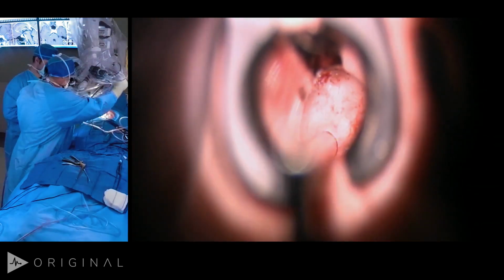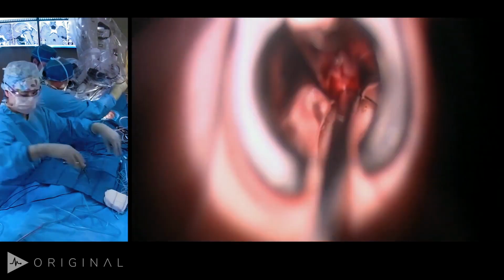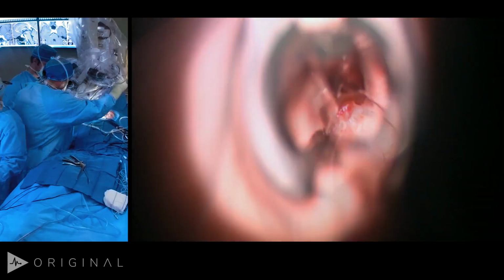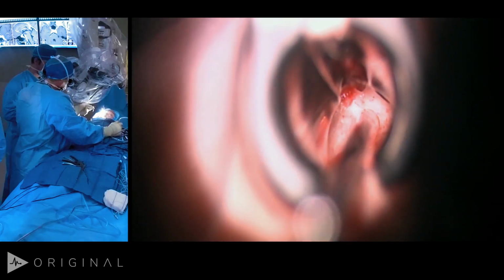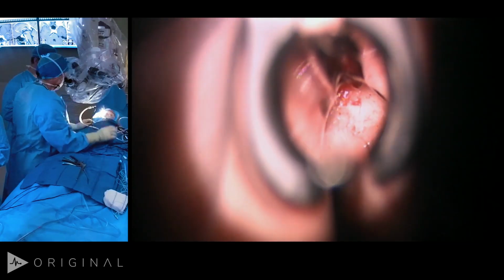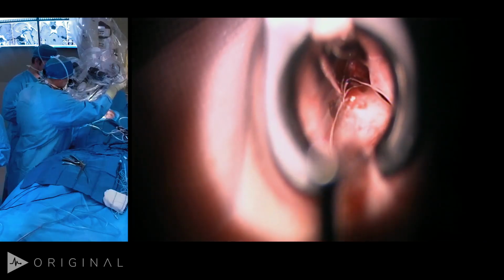In a thick sella, there's some abnormal bone in the sphenoid or the junction of the clivus with the sella that we'll leave alone. And I can feel the planum, frontal planum right up there. As we all know, there'll be a left carotid over there, a right carotid way over there. So we're going to start right there in the midline. And I usually like to confirm verbally with my colleagues that this is indeed the midline. So do we all agree that this is midline?